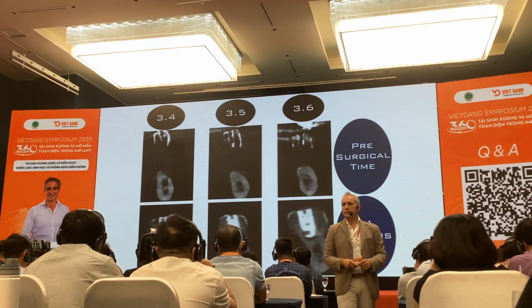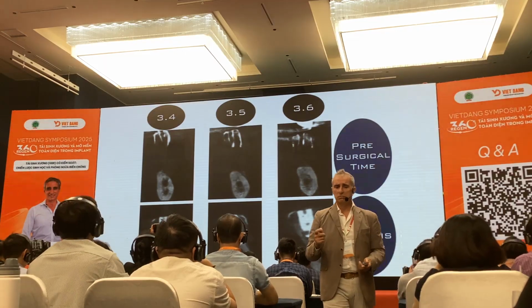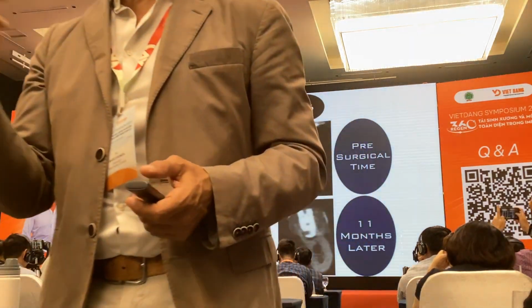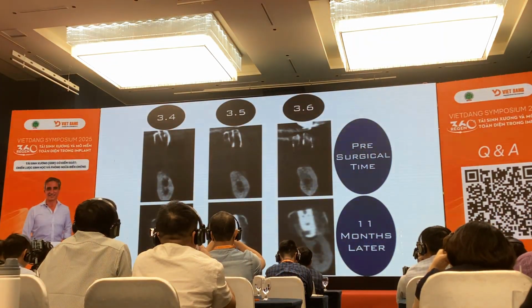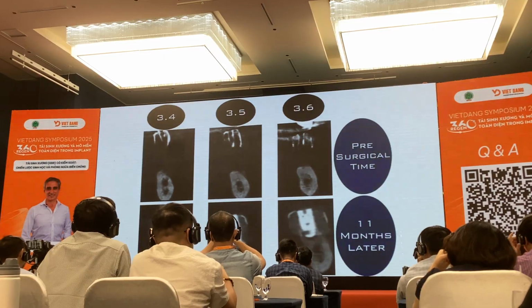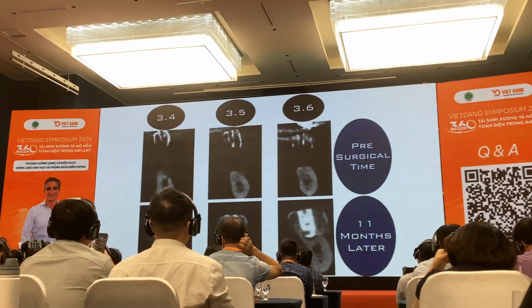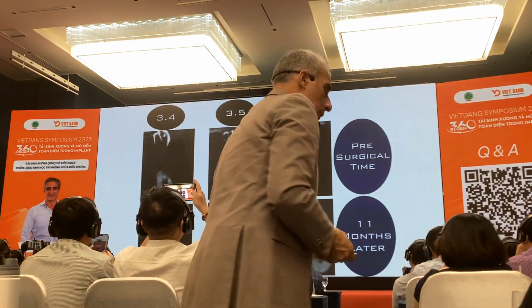You can see that the bone is black-gray, is transparent. It hasn't mineralization. But in any case, after this time, I observed that the quality of bone doesn't change.